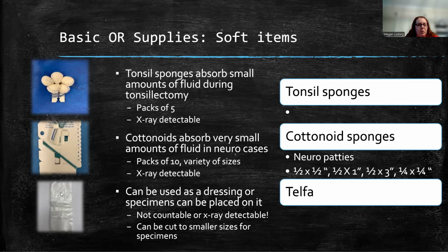But you can even get it a little bit wet, put your specimen on it to keep it moist if necessary, and then you can wrap that specimen up and hand it to your circulator to put it in the specimen container, however it needs to be sent. Okay, so that is Telfa.